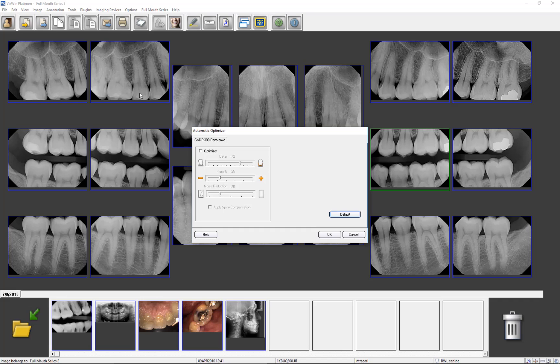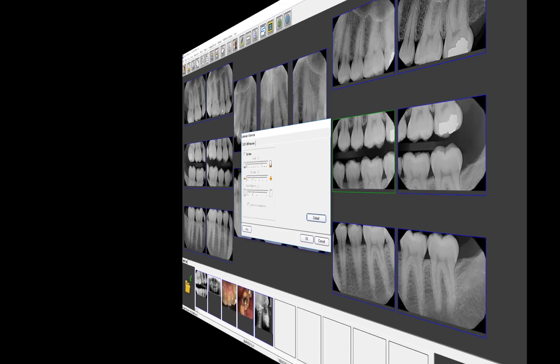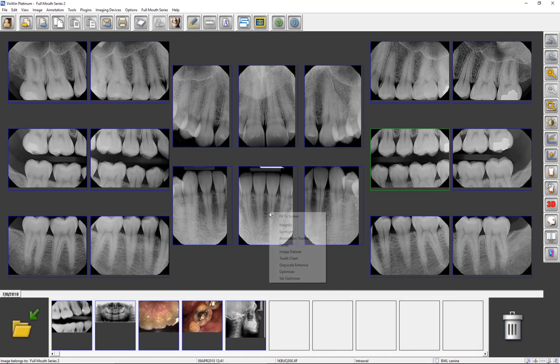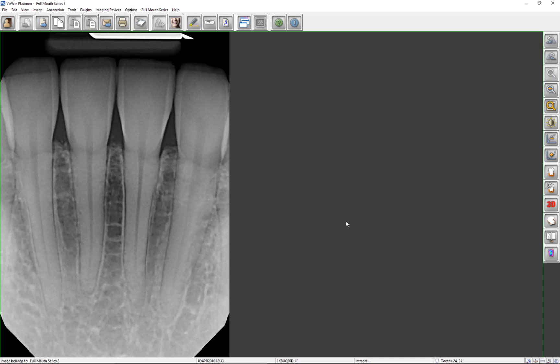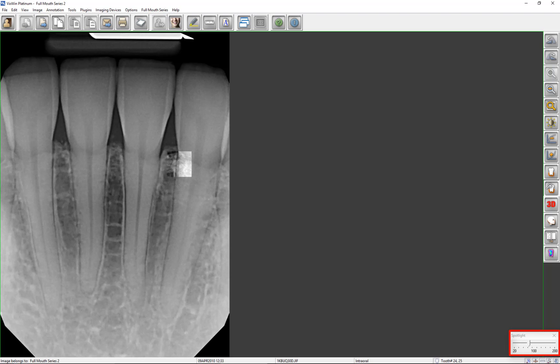A dialog window will appear where you can set the default sharpness, intensity, and noise level of captured images. The Spotlight feature further enhances image detail by maximizing the contrast in a localized, user-defined area. When Spotlight is selected, a dialog window appears where you can adjust the size of the highlighted area. To use the Spotlight tool, click on an image and then move the mouse over the area to spotlight.